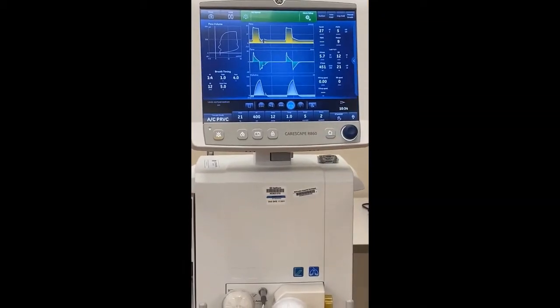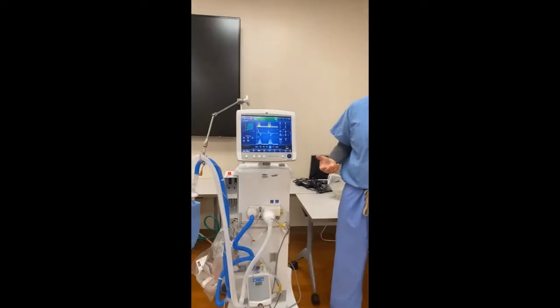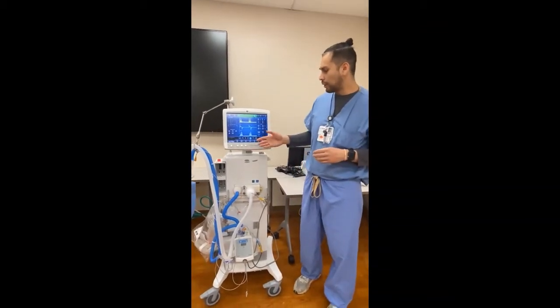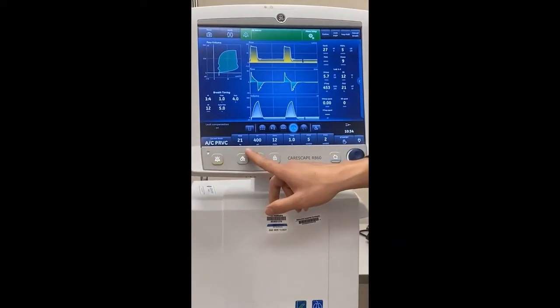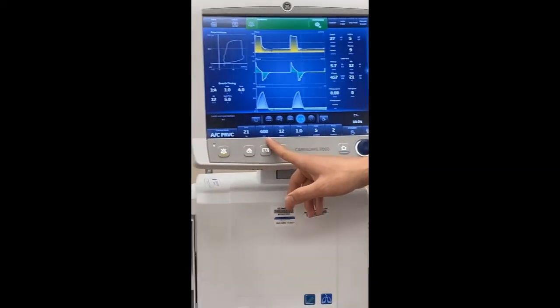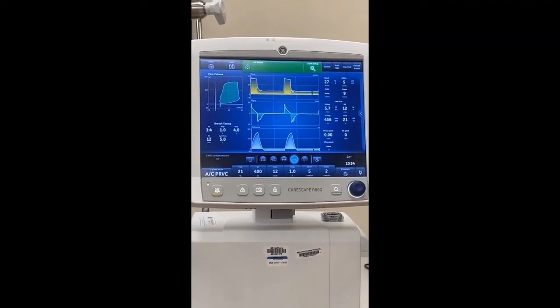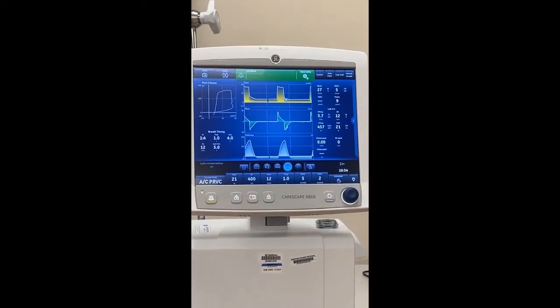The most important things from a nursing standpoint is when we're relaying information, if the patient needs to get upgraded, they need to transfer to a PCU side or to an ICU side, the most pertinent information that we want to deliver is the mode that the patient is in, the amount of concentration that the patient is getting, how much volume they are getting, the set rate that they are breathing at, and the amount of PEEP that they're receiving. Those are the most pertinent information that we want to give off on report when it comes to upgrading a patient's care.